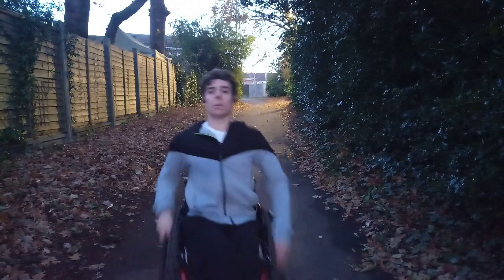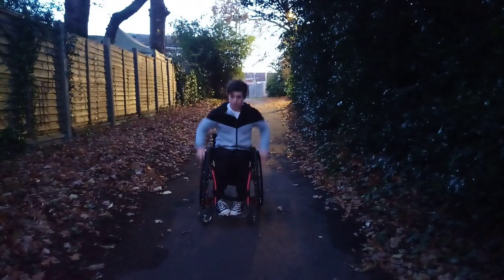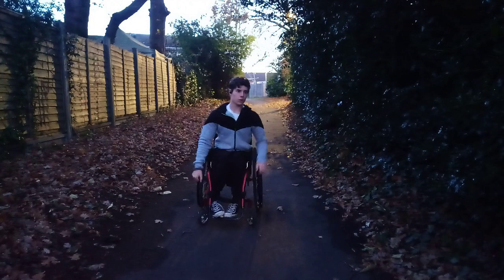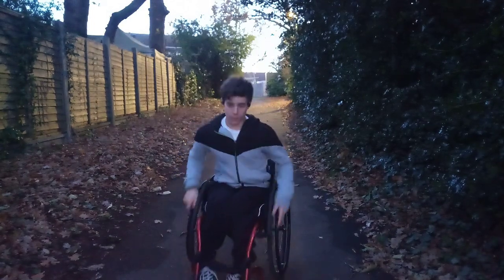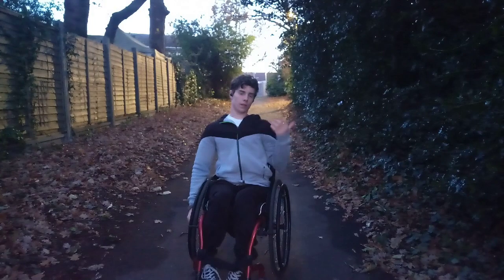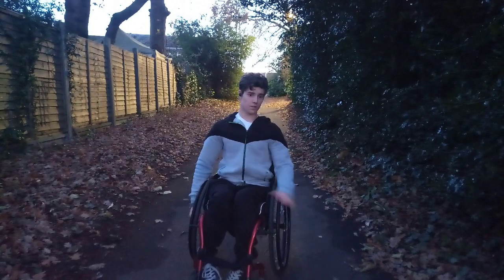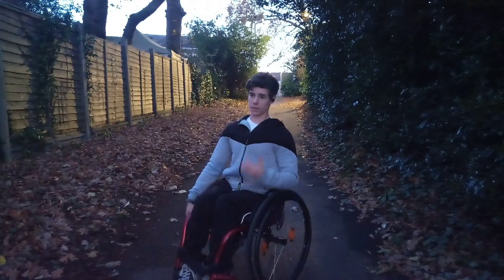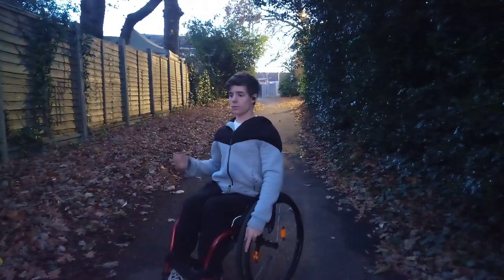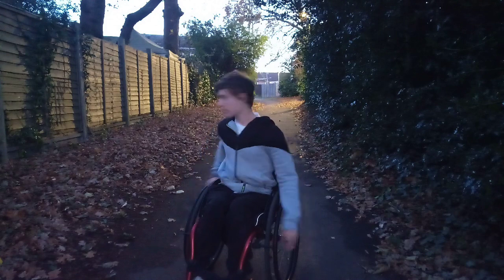So if I head back up here quickly, when you're pushing along, giving a bunch of pushes, you might not go anywhere at all because your wheels will just be sliding on the spot and you will not make it very far, or at least as far as you want to be. So pushing is a bit of an issue. This is if the ground is completely frozen. Obviously, it may be slightly different because the grip may be different. However, I would recommend keeping in mind that the wheels need a bit of an extra oomph to get you going because they will just spin on the spot.